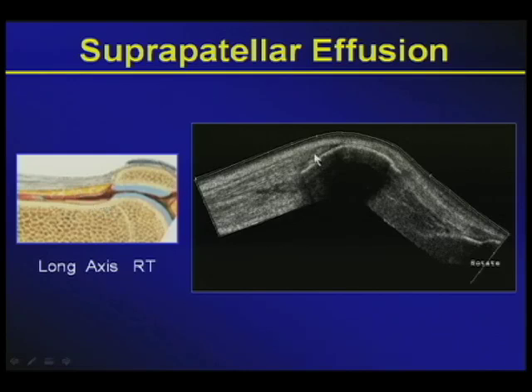In grayscale imaging, on an extended field of view, just concentrating on the superior part of the knee, you'll see the bone acoustic landmark of the base of the patella, the fibrillar pattern of the distal quadriceps tendon, the triangular hyperechoic suprapatellar fat pad, and between this triangular suprapatellar fat pad and the fat pad in front of the femur, also known as the prefemoral fat pad, you see a small amount of fluid. So this is the area that usually may and should give you some physiologic fluid.